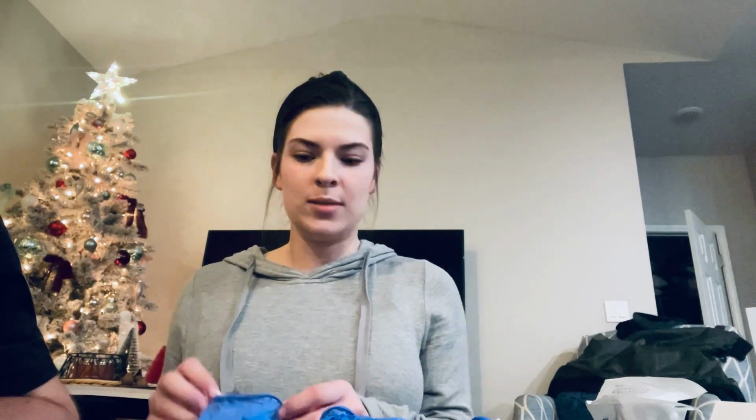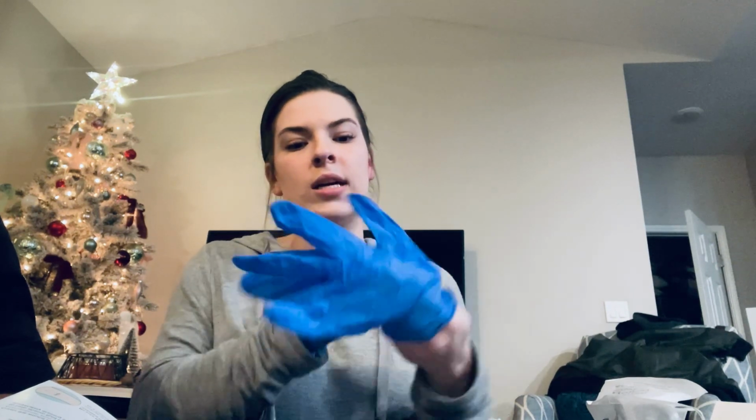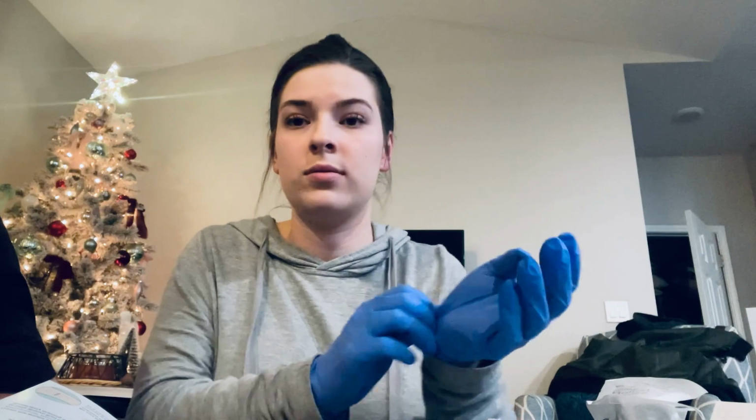Hello, so today I will be doing video assignment number 2 where I will be showing how to properly dress a wound. So the first thing that we need to do is be sure to prevent any disease transmission, and that will be by using our gloves, and how to properly use those is in video assignment number 1. So put on our gloves, and like in that video, it's important that gloves are latex free because you don't want to affect an individual's allergies on top of a traumatic injury that might have just occurred.